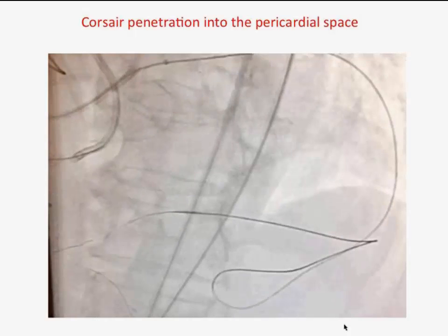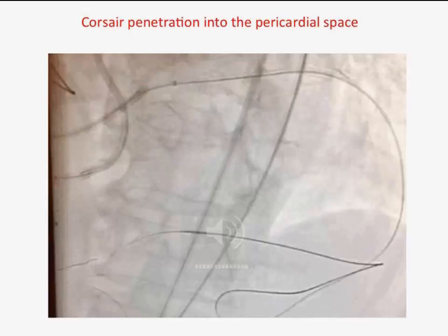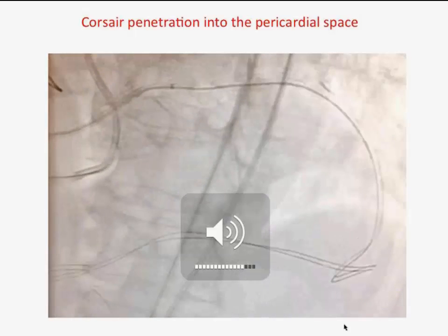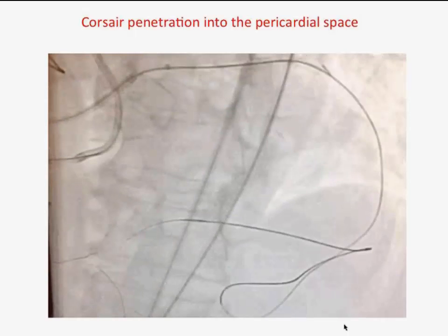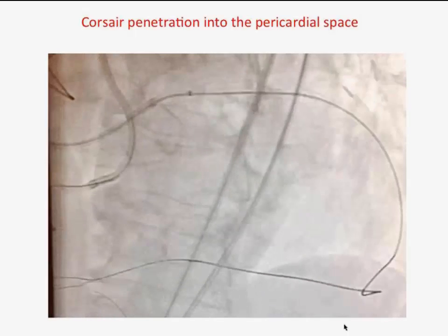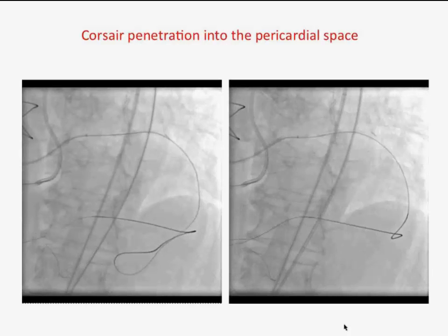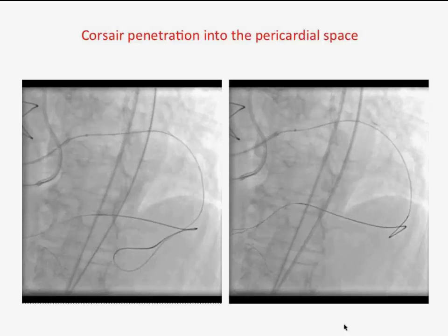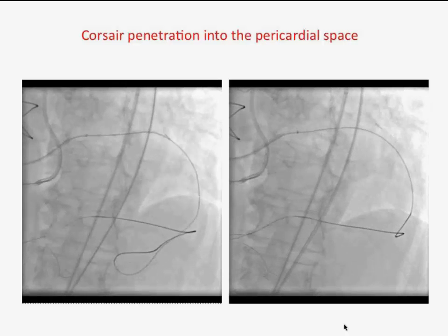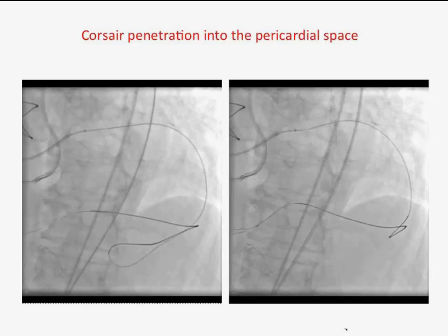Have you seen it? You know, it's complicated where you put the knuckle and somehow it just happens, but mainly in septals. I haven't seen it in the epicardials. Okay. So I was not happy, as you can imagine. And here, because at this point, the problem was that I couldn't use this wire anymore, and also the Corsair, because always when I tried to rotate it, I always got this prolapse.